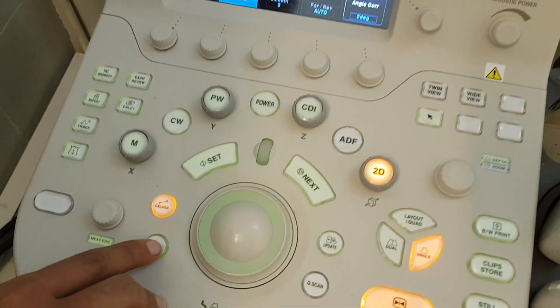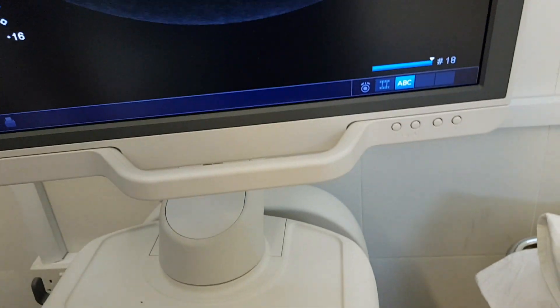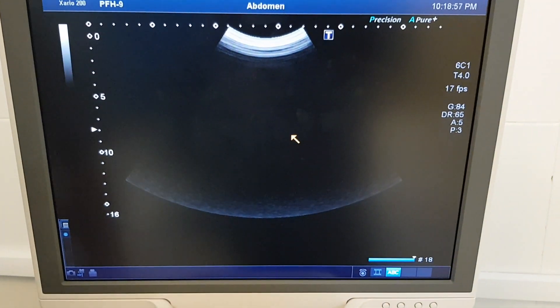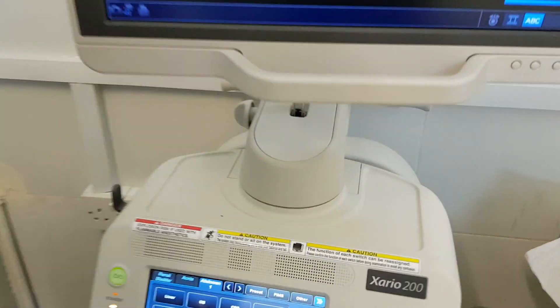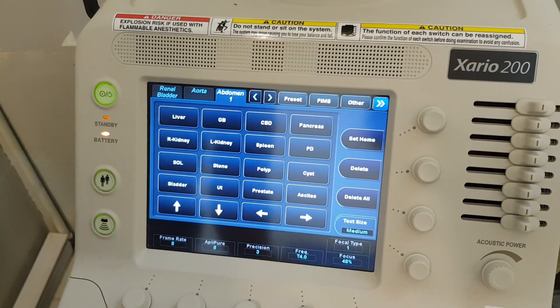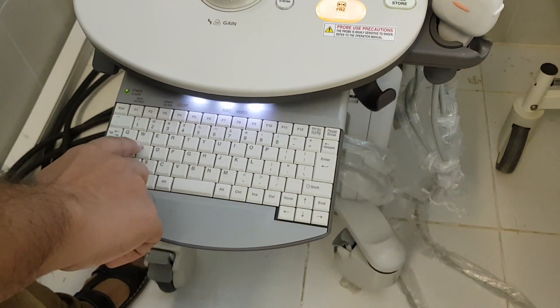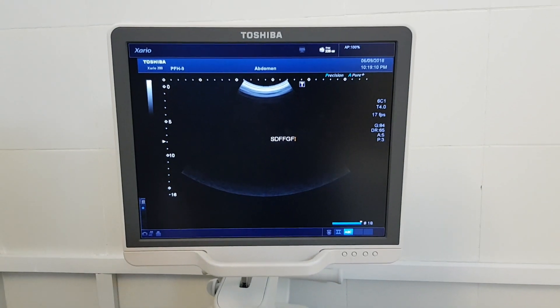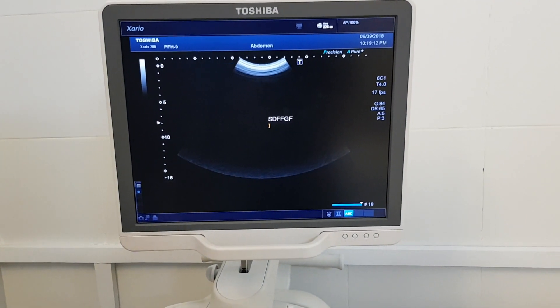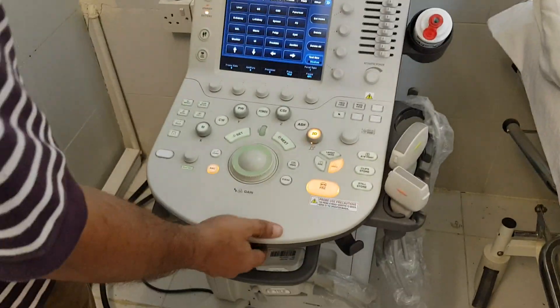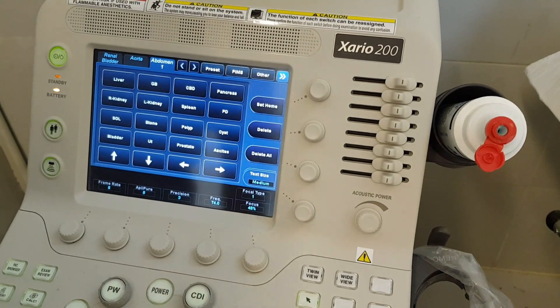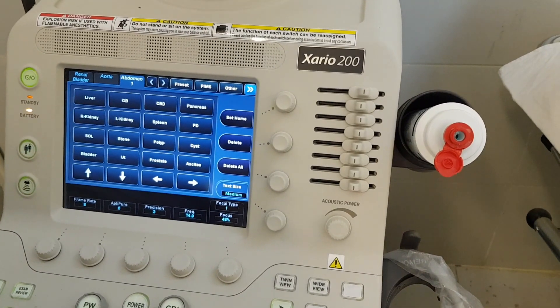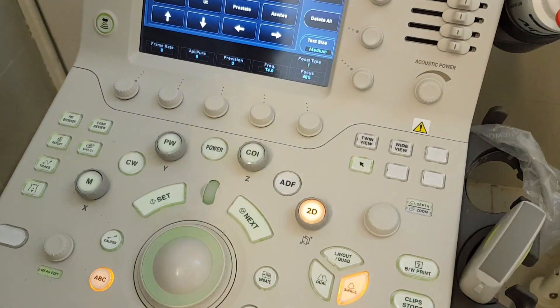Like this — for example, ABC. If you want to label it, you will click on it. Let's suppose this is a liver area, so it is also written. But if you have something that you have not written before, there will be a keyboard. If you type it, it will be typed. If you click the enter button, you confirm it — just like a computer keyboard. You can also change the direction of the arrow.